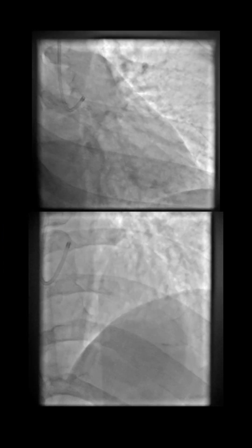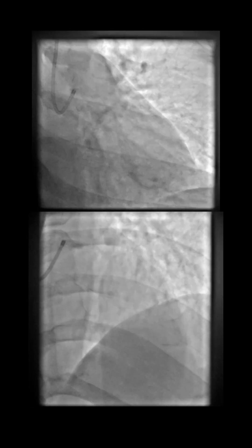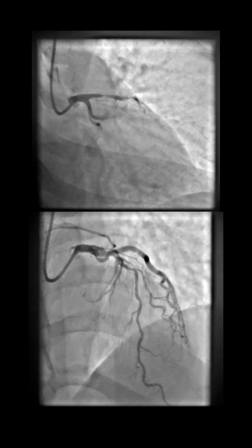This is our patient, a 34-year-old gentleman who presents with acute chest pain, a high-risk acute coronary syndrome with transient anterior ST segment elevation. Taken emergently to the cath lab, we found a critical narrowing in the proximal LAD and another severe stenosis in the mid-LAD involving the diagonal bifurcation.